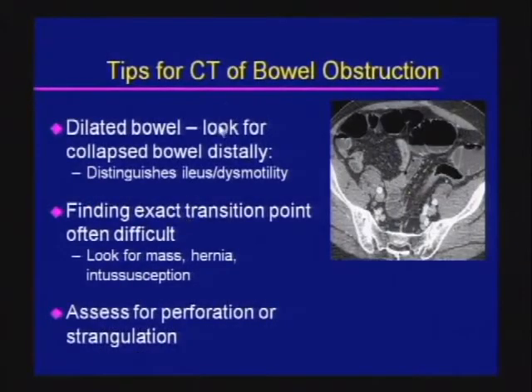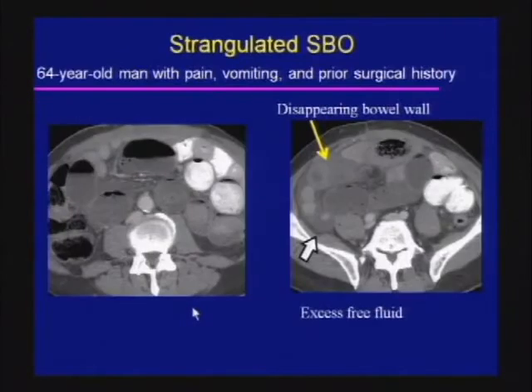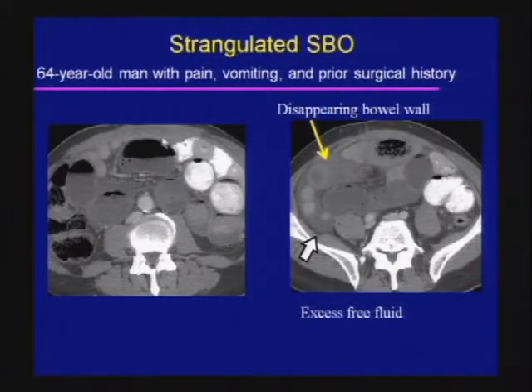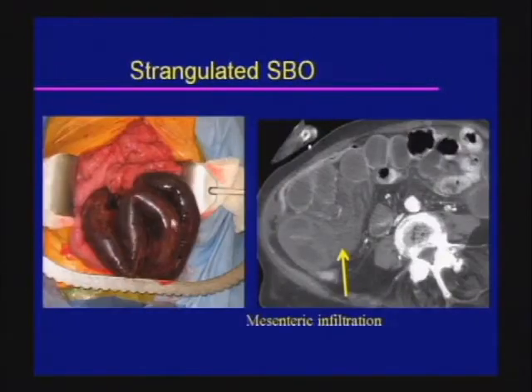CT tips: don't spend a lot of time looking for the transition point. Look in the general area for masses, hernias, and intussusceptions. Assess for perforation or strangulation. Signs of strangulation: a patient with pain, vomiting, and prior surgical history shows dilated loops of small bowel that don't fill with contrast, with loss of the enhancing bowel wall — the disappearing bowel wall sign. Excess free fluid within the area of the transition is also a sign. This patient had dead gut from a strangulated small bowel obstruction.